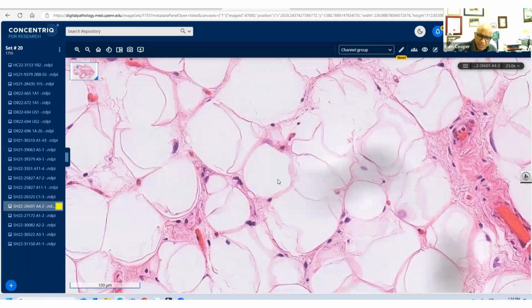All right. And that's how we look at it, because they don't recur that much. From my recollection of that paper, there's only about 12% recurrence. So it's much, much less than ALT, atypical lipomatous tumor, MDM2 amplified WDLS, well-differentiated liposarcoma, which can recur and can de-differentiate. So that's a nice paper to look at. And just look at all the pictures and you'll see the heterogeneity of the morphology, because no two tumors look alike, but it's the atypia that makes you think, this is not spindle cell lipoma.